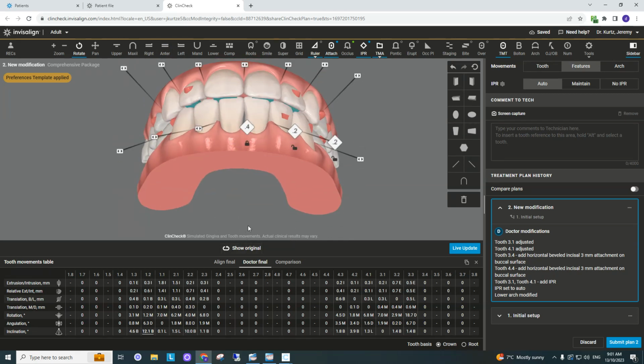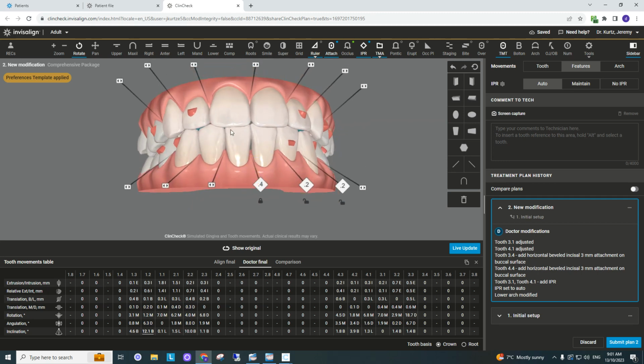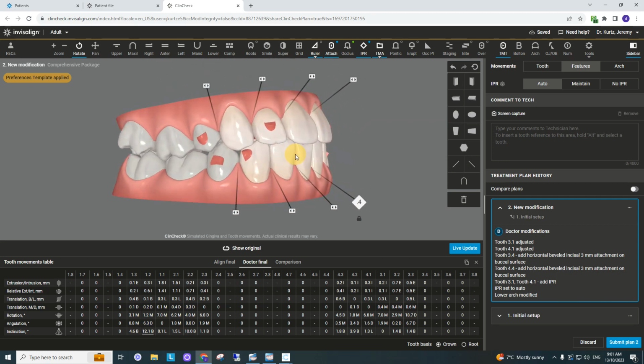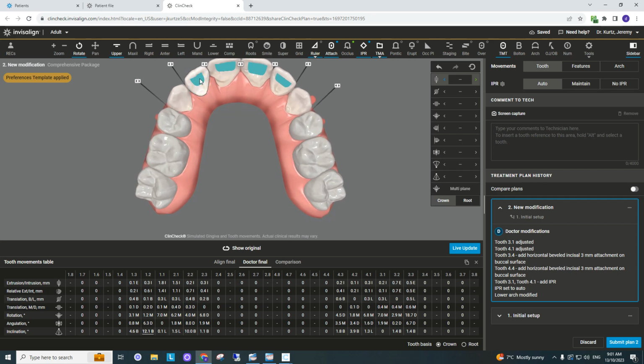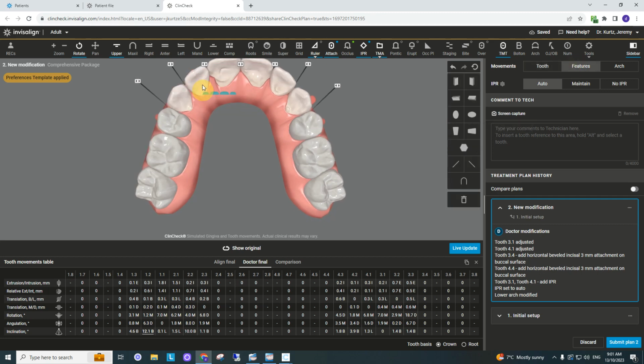I have bite ramps on my anterior teeth. The truth is, I could use them on the central incisors because we want to prevent posterior open bites, but I don't necessarily need them on the laterals. Now, unfortunately, if I try to modify it myself and I pull it off, what'll happen is I'll end up removing all of them. So I'm going to remove them, and I'm going to make a comment, place bite ramps on 11 and 21 only. Now, ultimately, I can't do live update because now I've typed, but you'll be able to do live update.